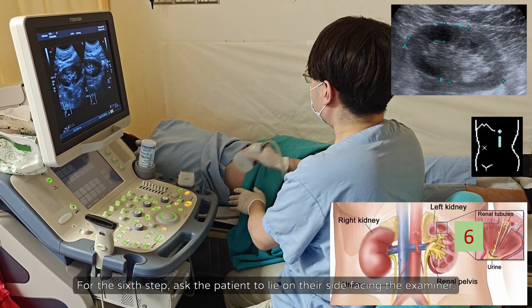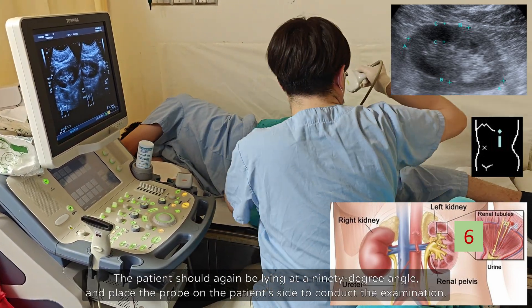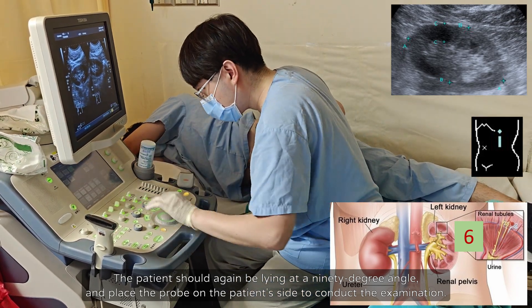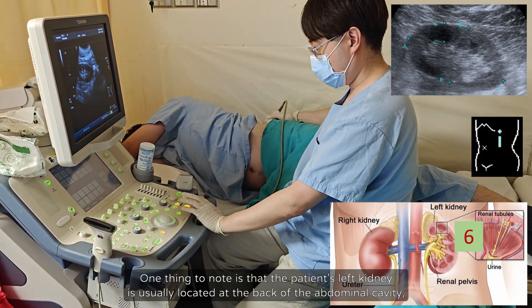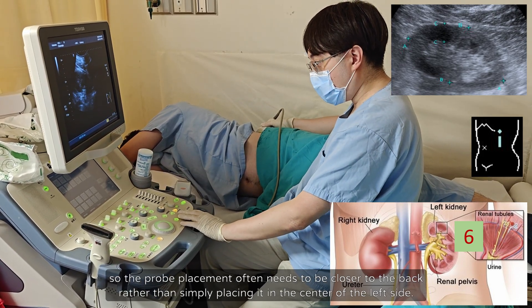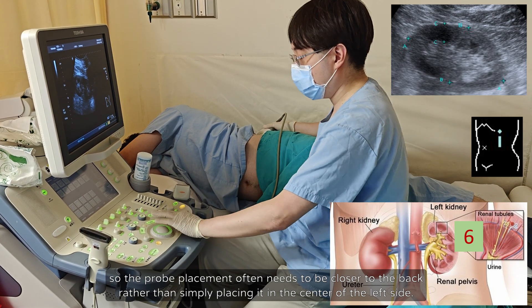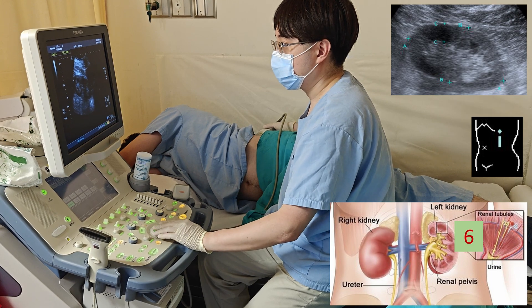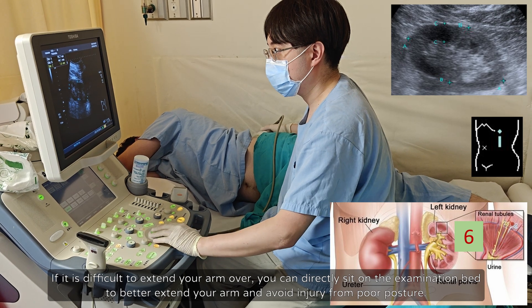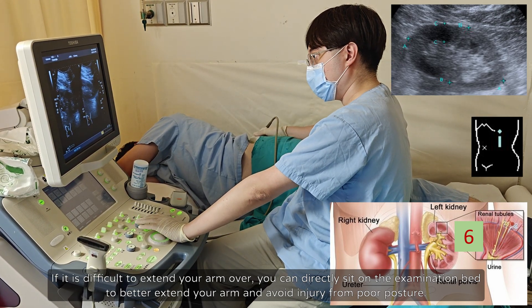For the sixth step, ask the patient to lie on their side facing the examiner. The patient should again be lying at a 90-degree angle, and place the probe on the patient's side to conduct the examination. One thing to note is that the patient's left kidney is usually located at the back of the abdominal cavity, so the probe placement often needs to be closer to the back rather than simply placing it in the center of the left side. If it is difficult to extend your arm over, you can directly sit on the examination bed to better extend your arm and avoid injury from poor posture.